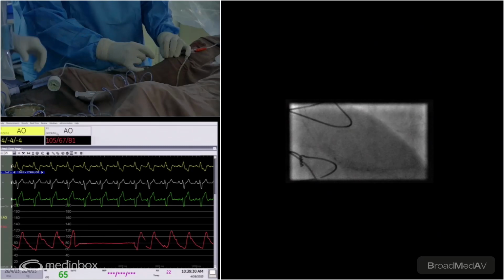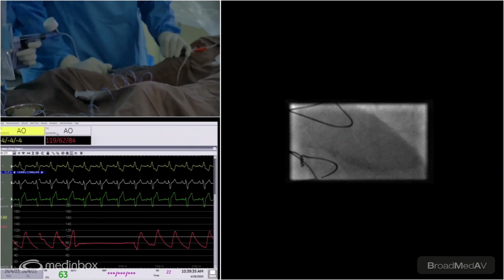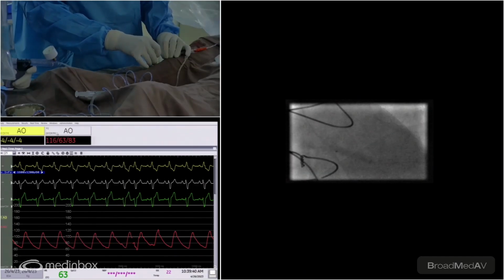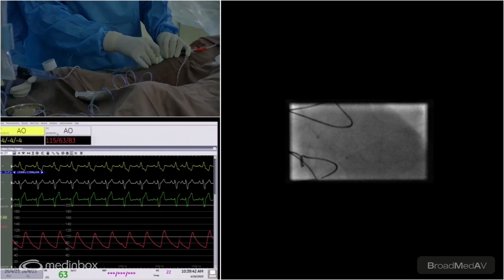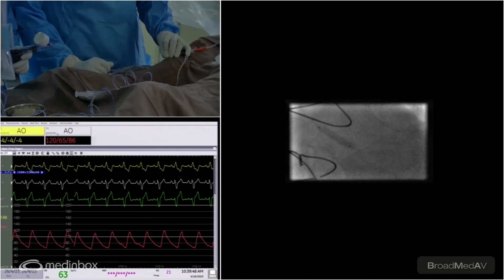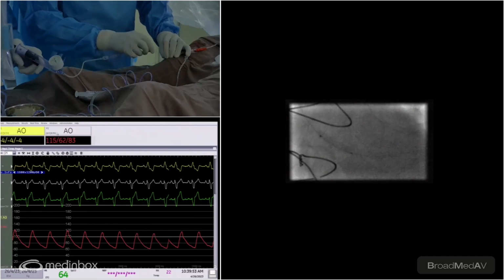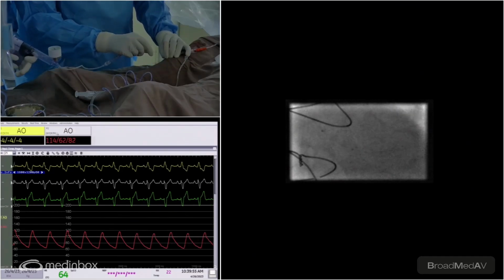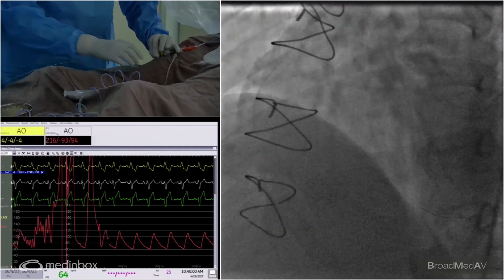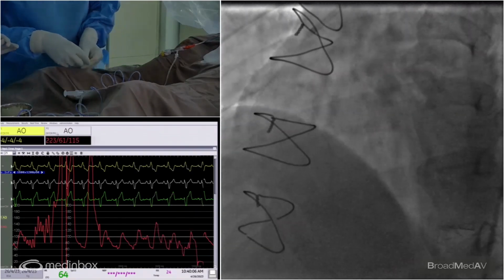We go up here again. 20. Keep the IVUS ready, sister, please. Okay, sir. Clear. Deflate, please. Go up again. 20. Okay, I think we've done well with the balloon. Open the collimation, please. We shall image and take a cine over here, see the distal flow, and let us do imaging and see how the optimization has happened.